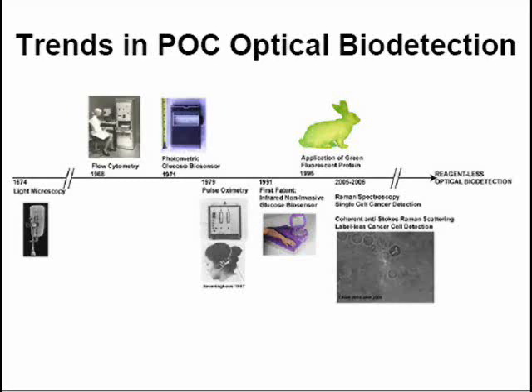And of course, skipping ahead about 300 years or so, we have our first flow cytometer. It's a rather large device, and for those of us that are familiar with current day flow cytometry, we can see that this is completely useless and not capable of point-of-care testing, at least at that time. About 3 years later, we have the first introduction of the Ames reflectance meter. This is the first photometric glucose meter, as well as the first handheld glucose meter in general. It was a rather interesting development, which essentially started off the whole area of point-of-care testing, especially in diabetic patients.